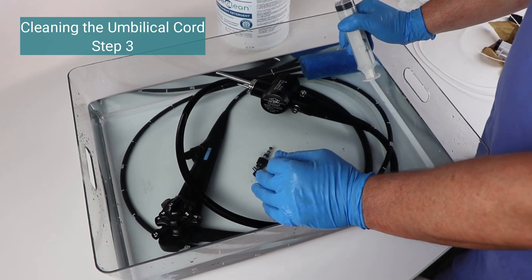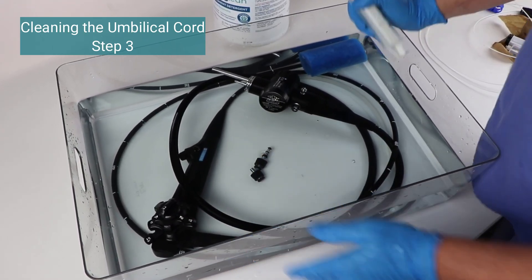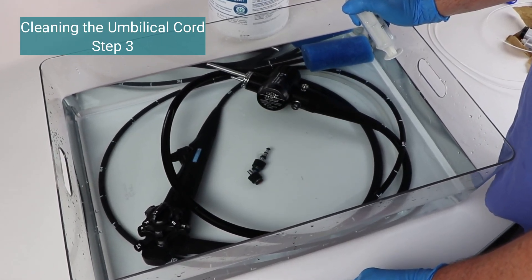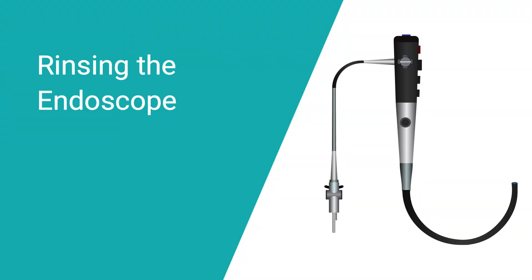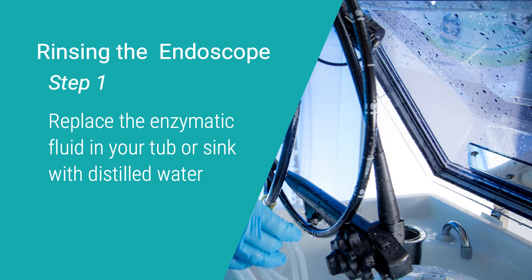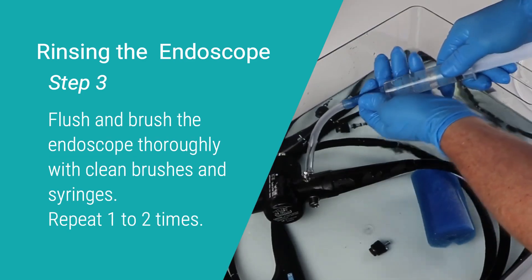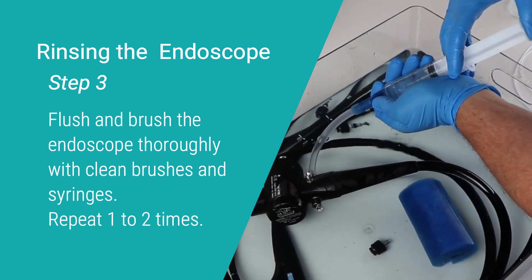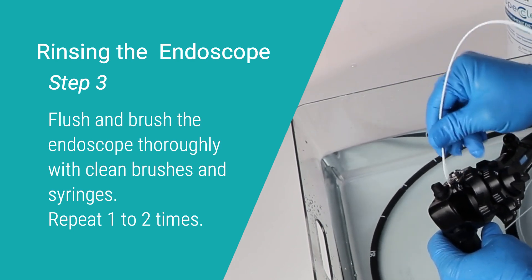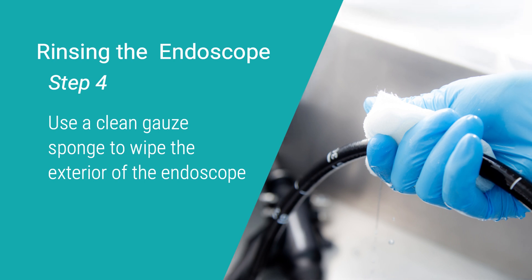Step 3: Let the endoscope soak in the enzymatic cleaning fluid for approximately 15 to 20 minutes. Do not over soak, as it can damage the endoscope components. Rinsing the endoscope — Step 1: Replace the enzymatic fluid in your tub or sink with distilled water. Step 2: Rinse your brushes and syringes in the distilled water. Step 3: Flush and brush the endoscope thoroughly with clean brushes and syringes. Repeat 1 to 2 times. Step 4: Use a clean gauze sponge to wipe the exterior of the endoscope.